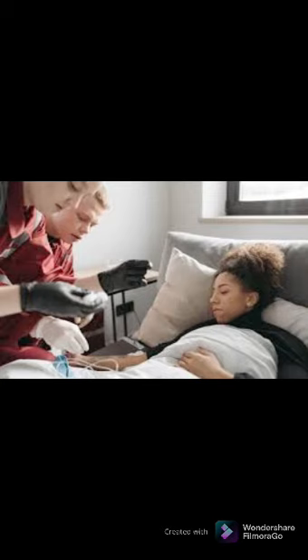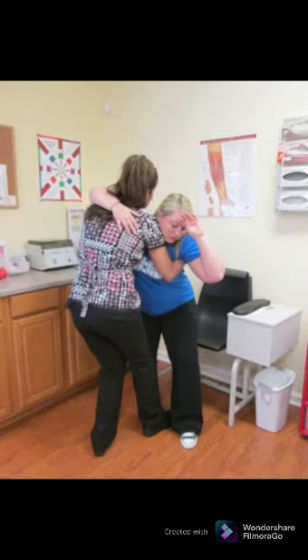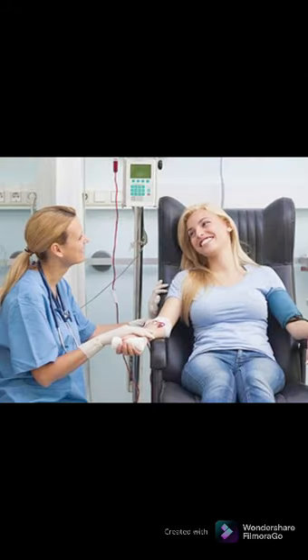Steps to follow if a patient starts to faint: release the tourniquet, remove and discard the needle as soon as possible. Apply pressure to the site while having the patient lower their head and elevate their foot, and advise them to breathe in deeply. Talk to the patient, physically support the patient, explain to the patient what happened, and assist them in loosening a tight collar or tie.